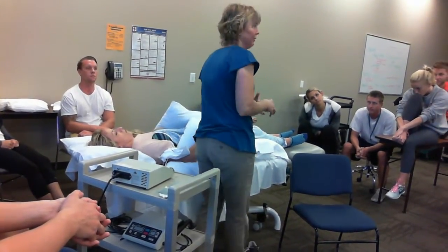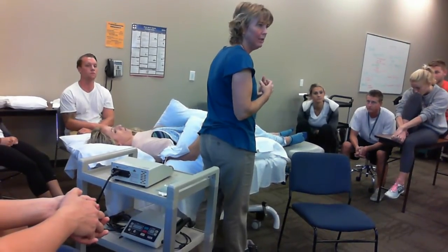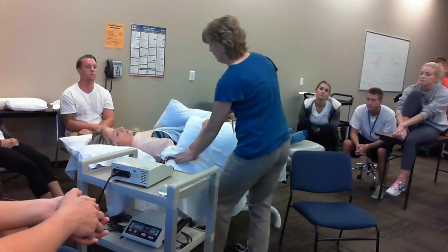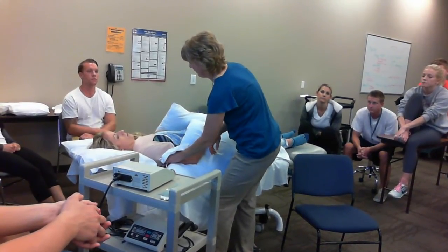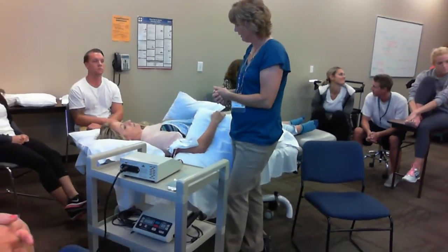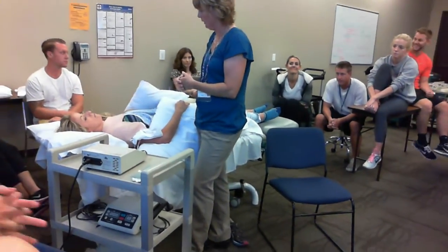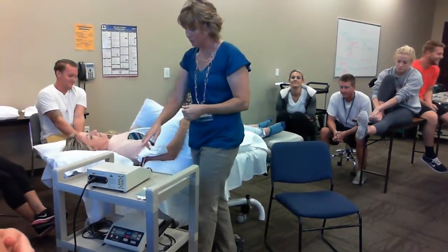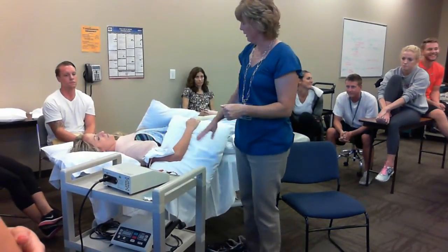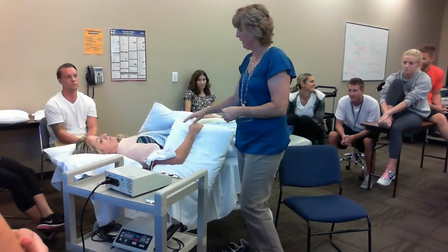What if she didn't know? Well, I'm not sure what I could do. I could slip my hand in and maybe feel if I feel any pulsing. No, I don't. Okay, tingling. And she says, that's strong and it's comfortable. Okay, we'll start. To actually get the timer running, I have to hit start. Start. You have your bell, I'll be back in 15 minutes.